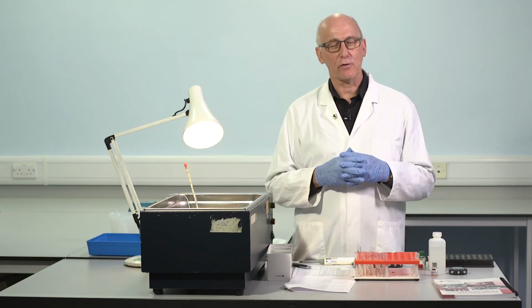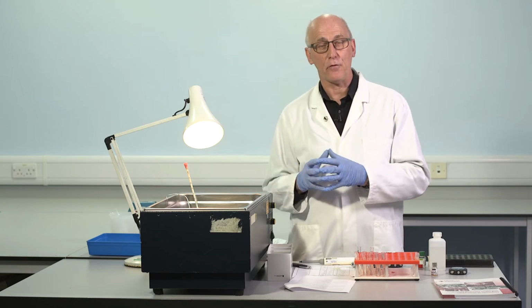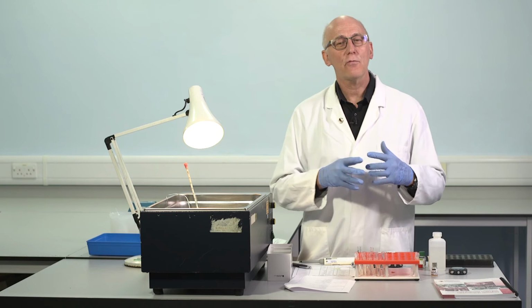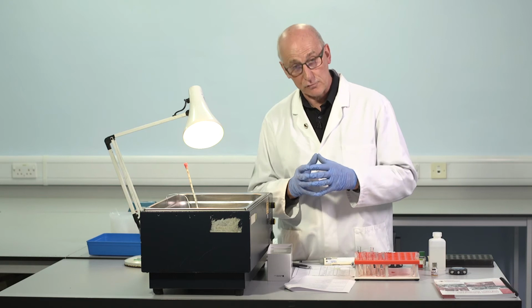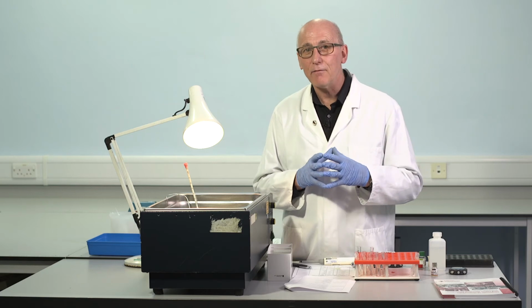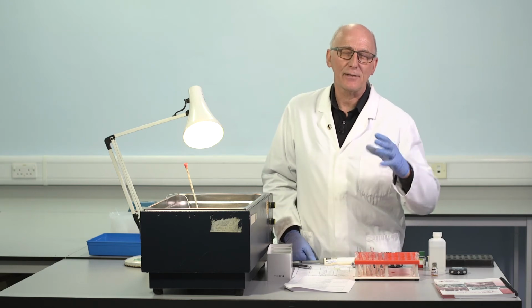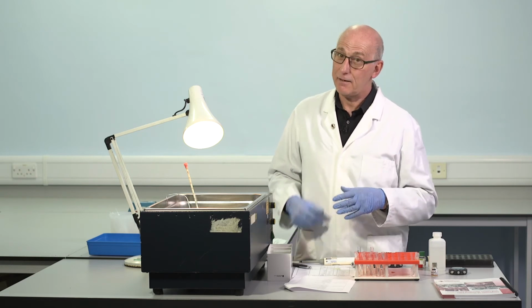Any patient mixtures with clotting times very similar to this clotting time for buffer alone, sometimes called blank time, sometimes called buffer time, any patient mixtures with clotting times similar to this don't have sufficient factor VIII in to have any impact on the dose-response curve. And if the clotting times are similar, they almost certainly contain a very similar level of factor VIII to the buffer. In other words, no factor VIII. So it's a really useful piece of information that allows us to say any clotting times around this, such a patient sample is probably lacking any factor VIII.